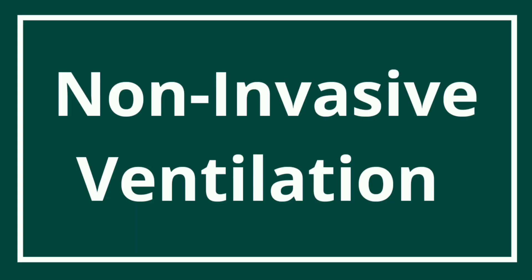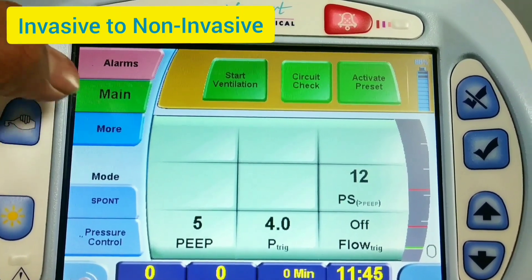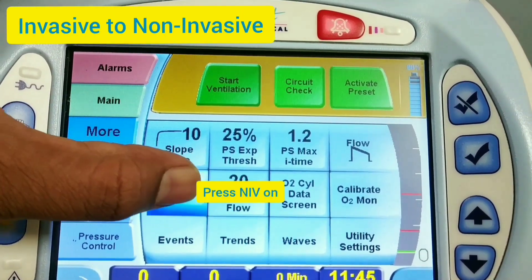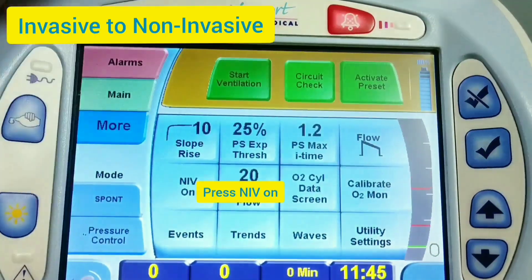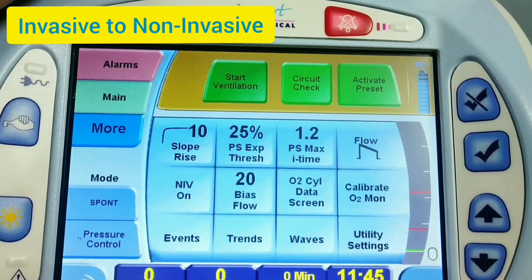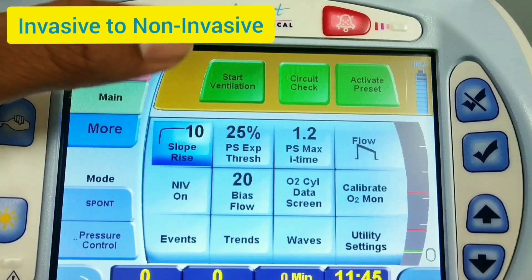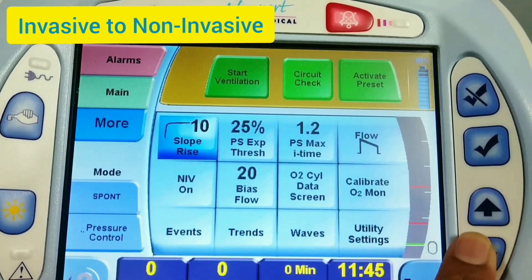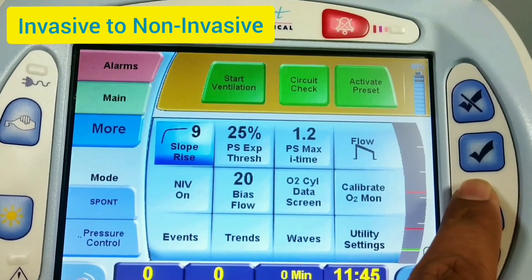Now for the settings for non-invasive ventilation. To start the non-invasive ventilator, press the More button, then switch on NIV and tick mark it, so the NIV will be on. If you want to change the slopes, you can adjust using the up and down keys and the slope will get changed.